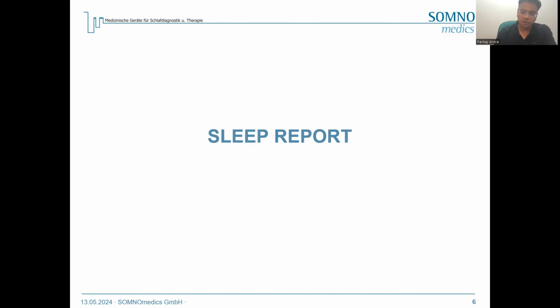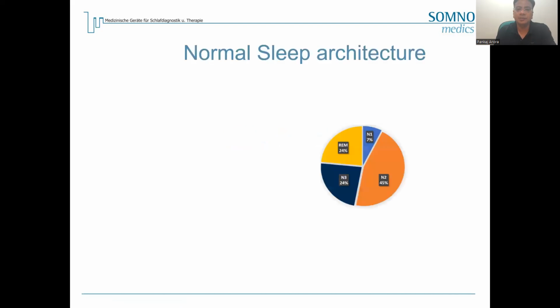The patient has come to you for a sleep study because he was feeling lethargic and tired during the day, and he was not able to work at the optimum level in the day, and that is why he has come to the sleep lab. So it means his sleep was fragmented. We need to look at how the patient is sleeping during the night, and that is why we are interested in the sleep report.